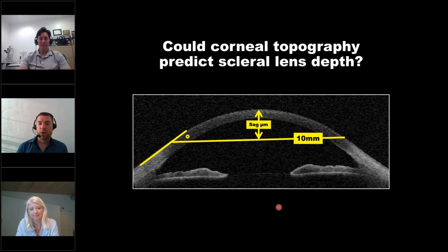It very accurately, or at least very closely, determines the sagittal height, and then it's just very easy to determine the sagittal height of your first initial lens, and it saves you a lot of time of fitting trial lenses from your trial set, otherwise putting lenses on and seeing it's too deep, it's too shallow, and this way you save just an enormous amount of time. It's nice to put one diagnostic lens on if possible, isn't it? Yeah.